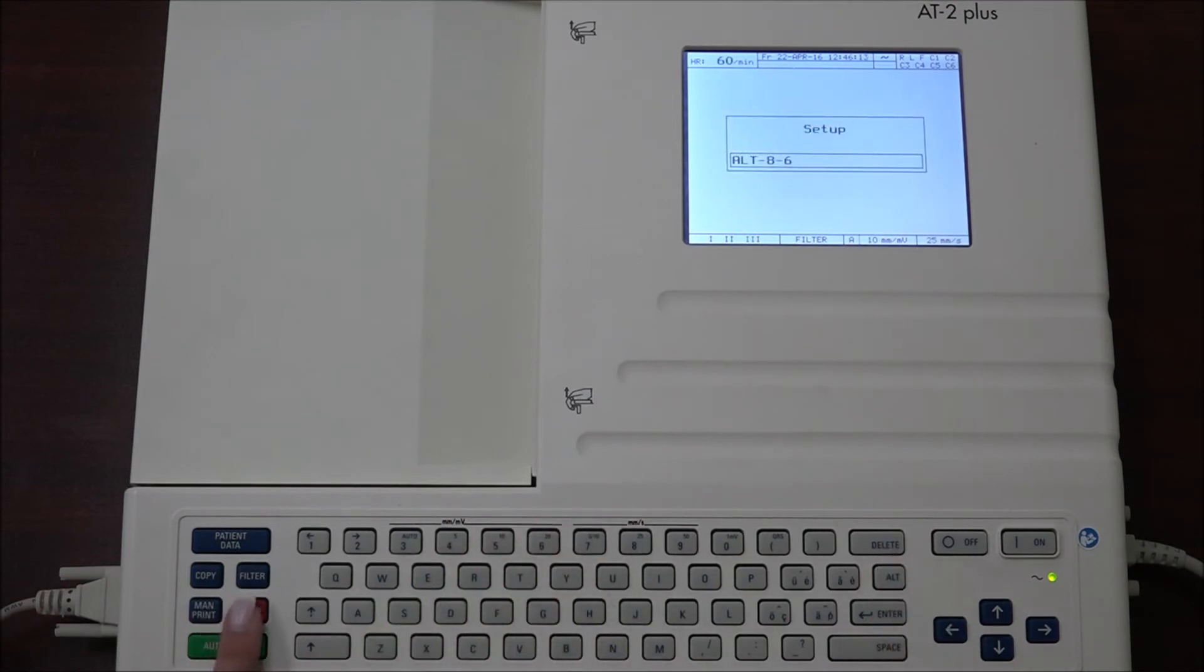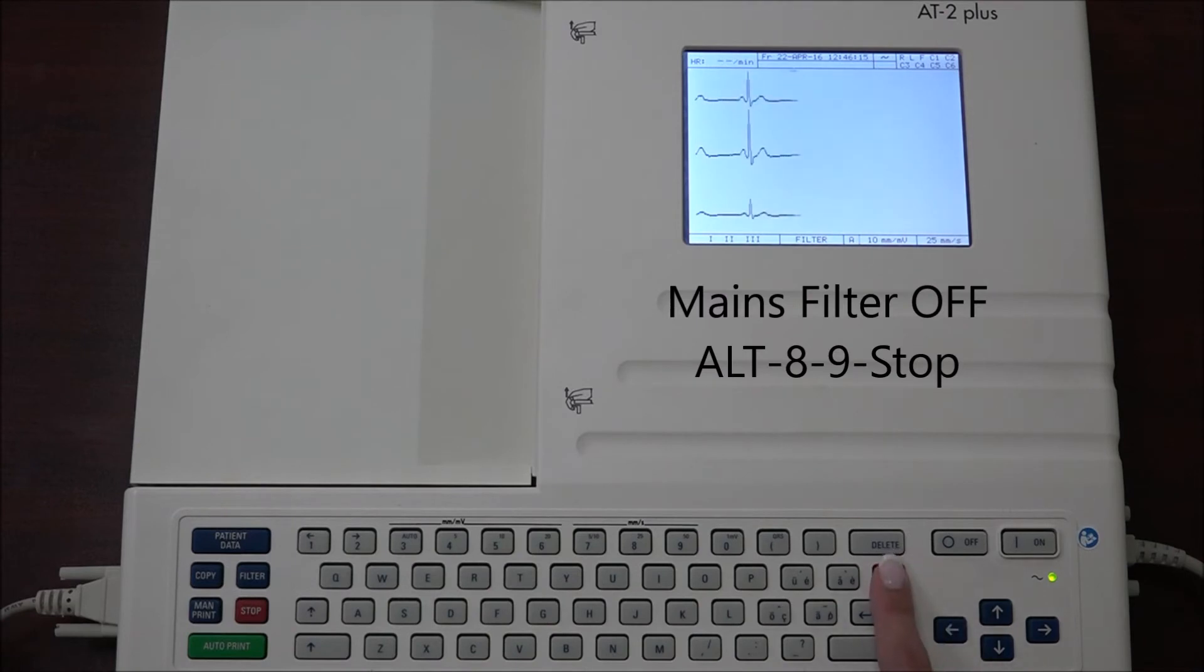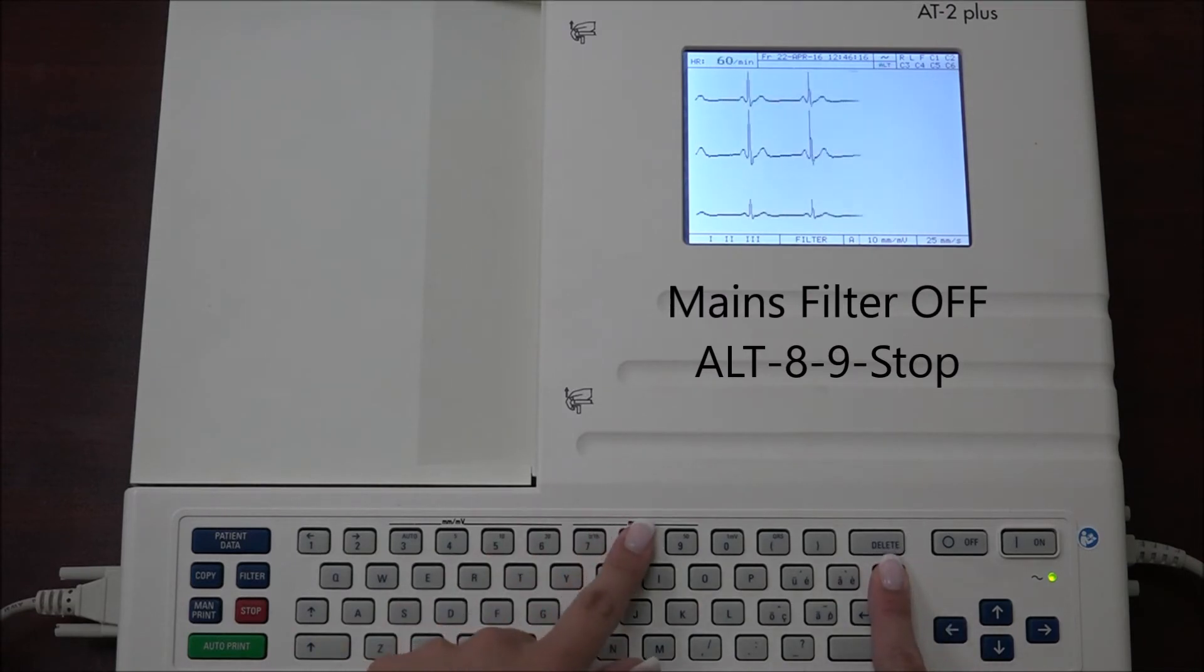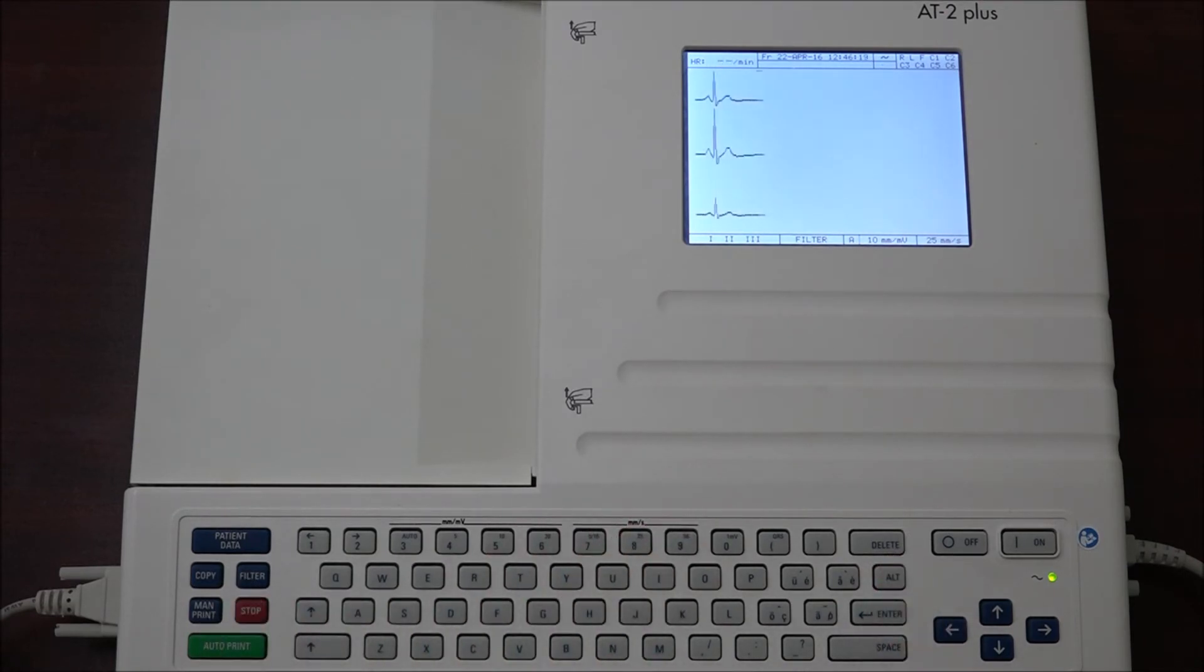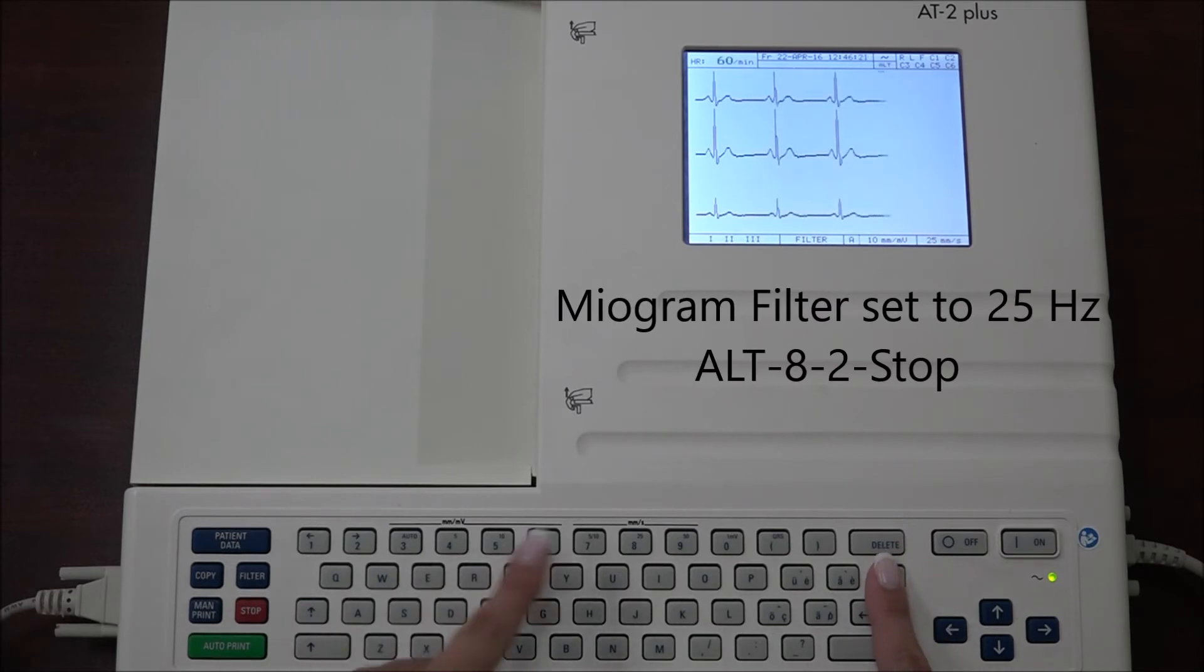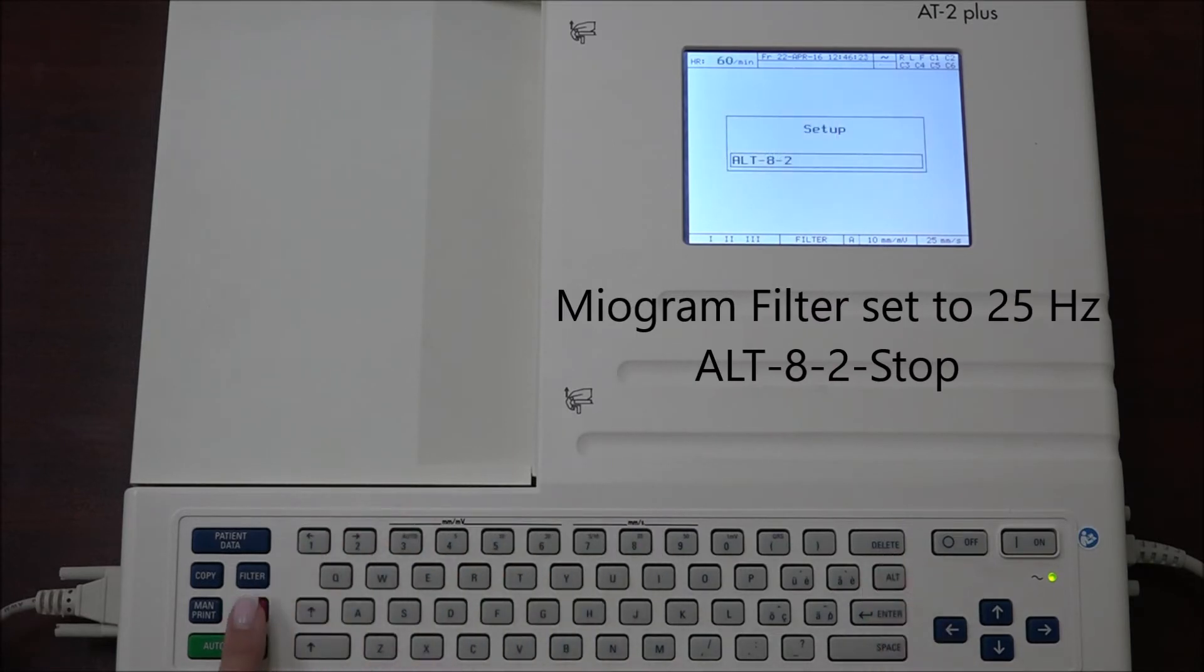To turn off the mains filter, press ALT 8 9 stop. The myogram filter can be set to 25 Hertz by pressing ALT 8 2 stop. This is usually the set configuration.